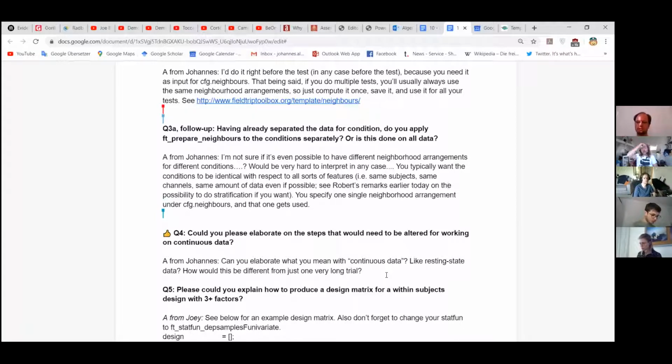Yeah. Actually, this is perhaps relevant for those of you working with an Electa Neuromag machine. The Neuromag machine has the MaxFilter software, and the MaxFilter software is using a rather sophisticated mathematical approach for filtering out external versus internal sources. But the MaxFilter software can do more than that. It can also project the data onto a standard position of the head relative to the sensors. And actually, that's what this question relates to. Can you compute the magnetic field at locations where you actually have not recorded it? That's what MaxFilter does. There are other approaches for that as well.